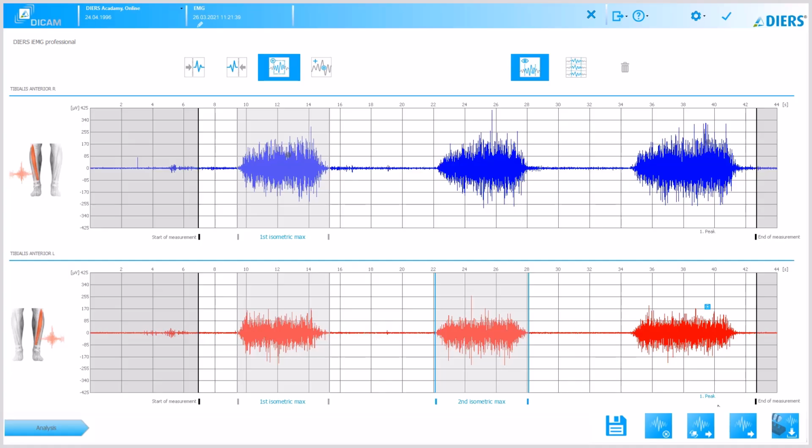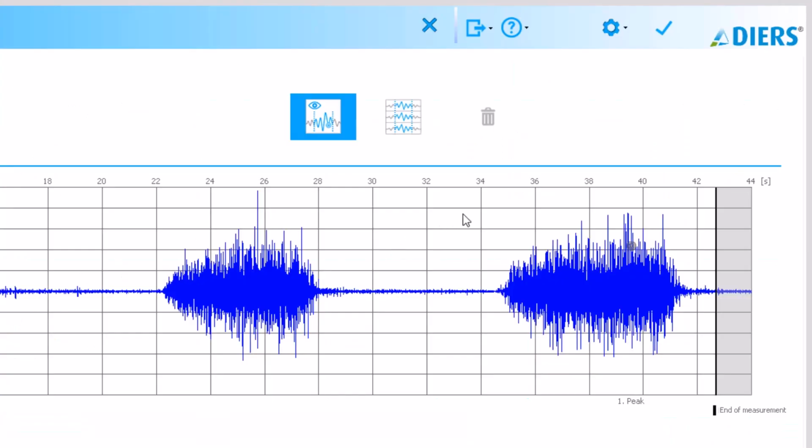If I want to apply the changes, I press Save, otherwise none of the processing will be applied. I can select two more options at the top. I can either show or hide the inserted landmarks and sequences, and I could undo the whole edit by clicking on the Delete button.